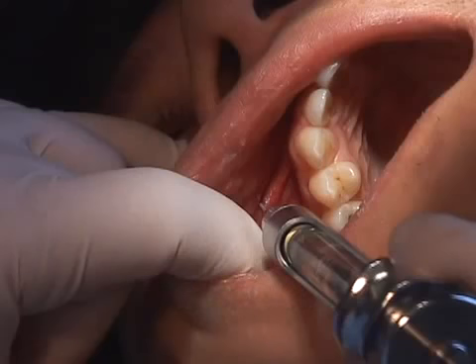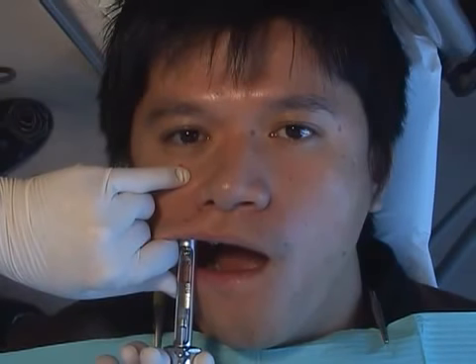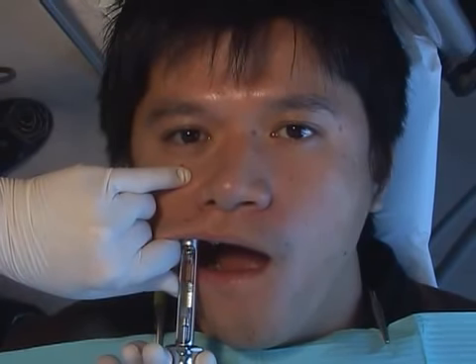Notice that the syringe angle is not towards the apex of the teeth, as it would be with a supraperiosteal infiltration. Rather, the syringe is directed towards the foramen that was previously identified by extraoral palpation. This is necessary to avoid premature bony contact and depositing the anesthetic solution below the foramen.